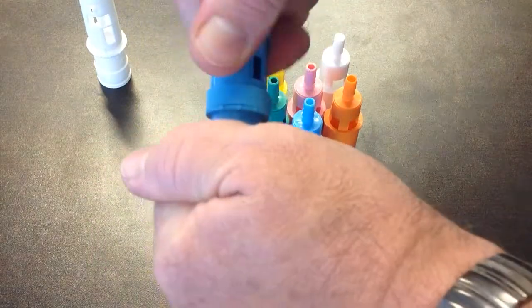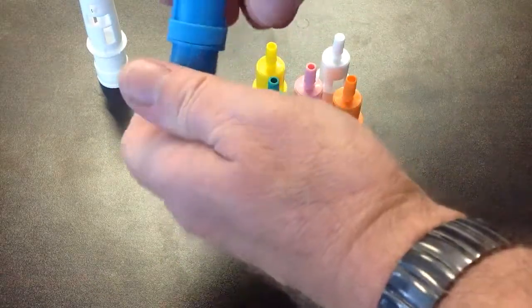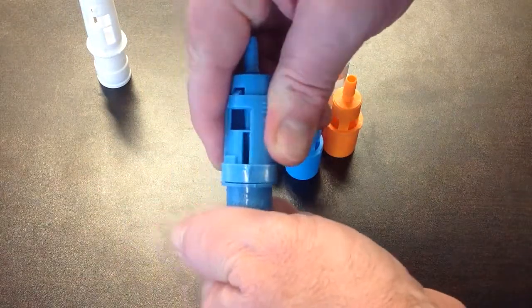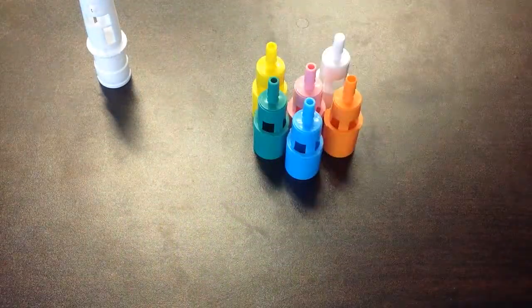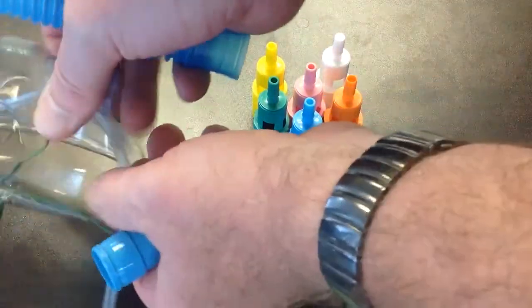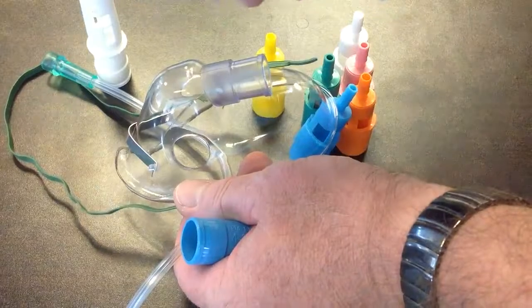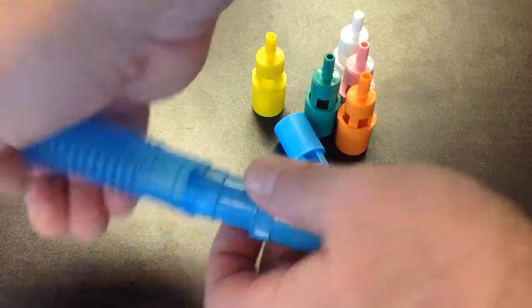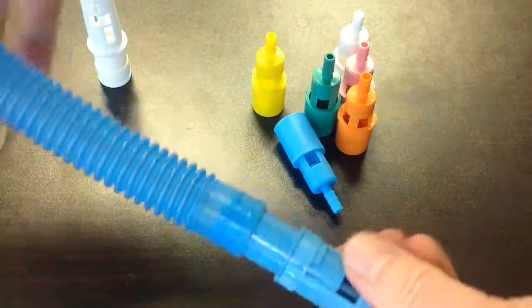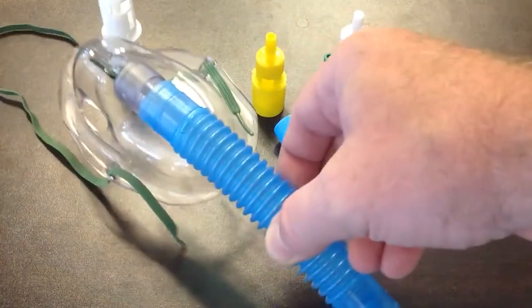As you get higher or lower oxygen, the port gets bigger. Okay, now you can't just have the patient sitting around on the port. What comes in it is you have a mask, 6-inch piece of corrugated tubing, and your ports, and regular oxygen tubing. You take this, put it in there, put the mask on, and it looks like this.